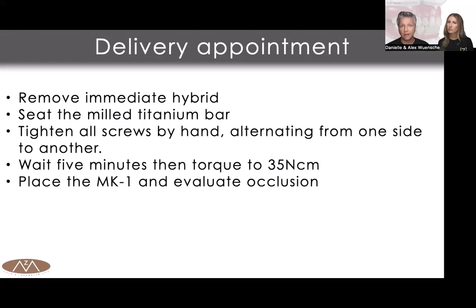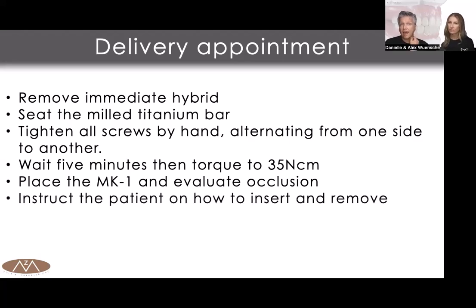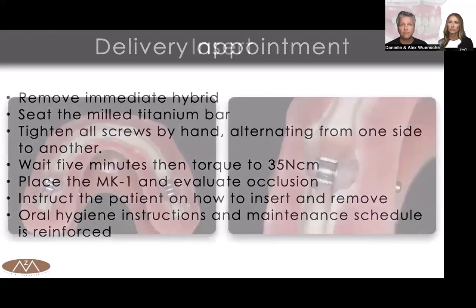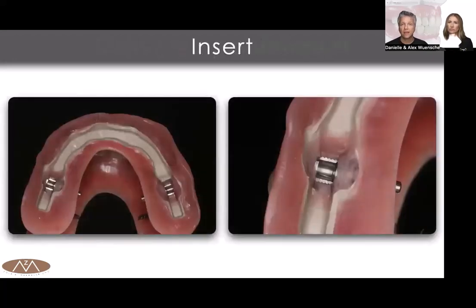Place the MK1 case, evaluate occlusion, make sure everything is nicely adjusted and in excursions, and then instruct the patient how to insert and remove. That's very important. The patient has to be comfortable inserting and removing that restoration. And then some instructions for oral hygiene, and we schedule a next appointment, right?